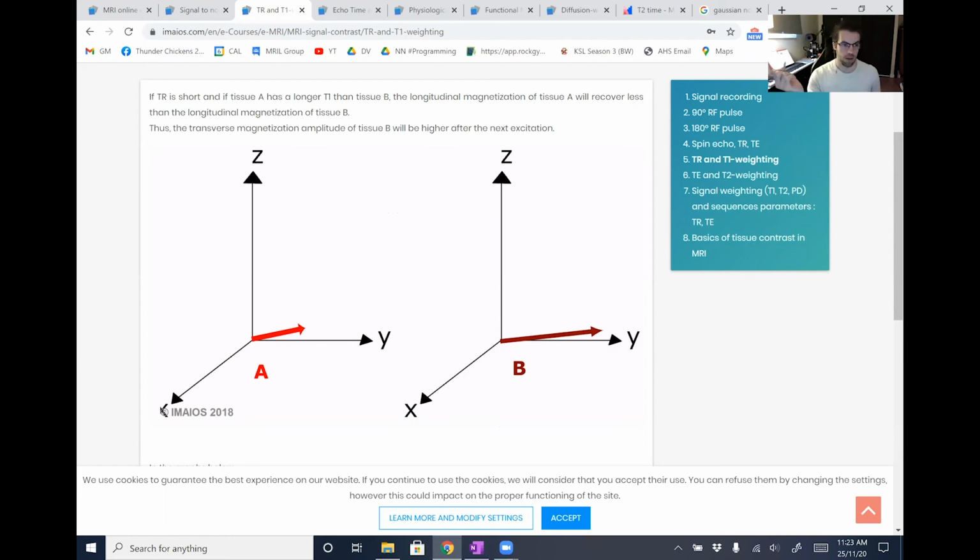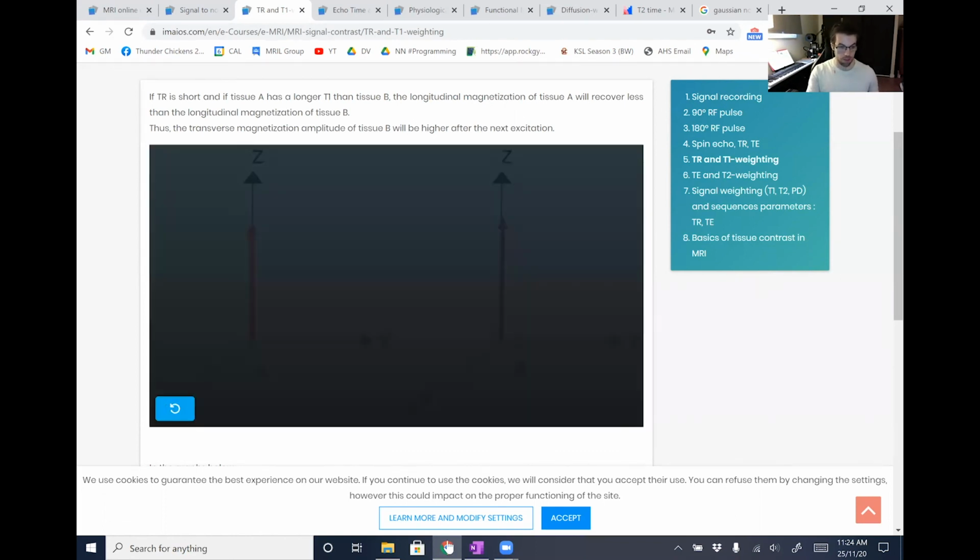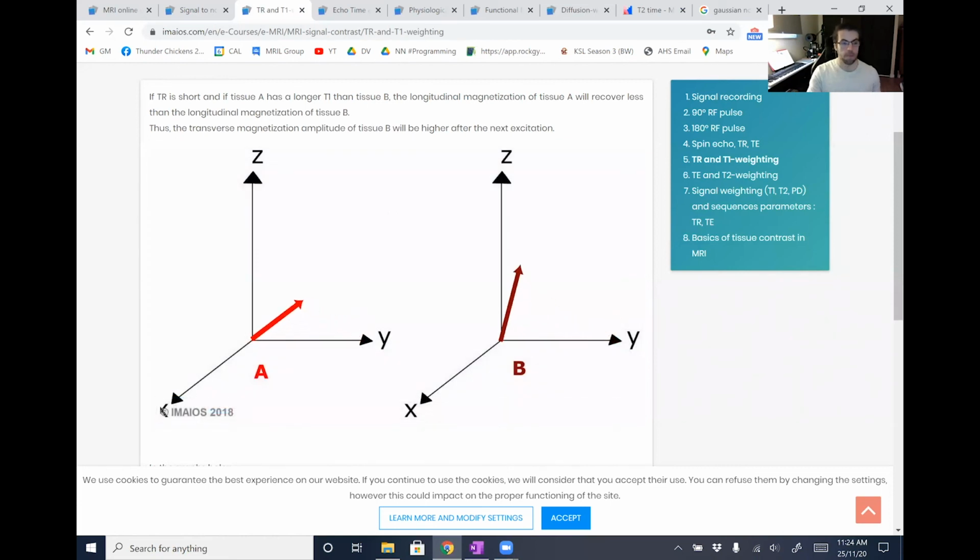And now we're going to see a difference in the tissues of our reconstructed image, thanks to our frequency and phase encoding. So I'll play this once again, just to give you an idea of the trajectory of the T1 weighted pulse sequence. There are 2 RF pulses, and hopefully this helps you to understand why.